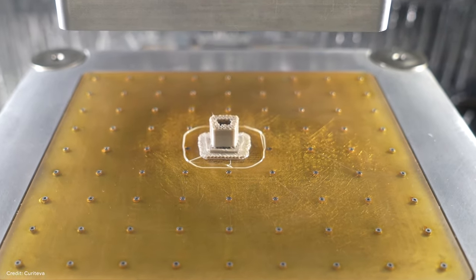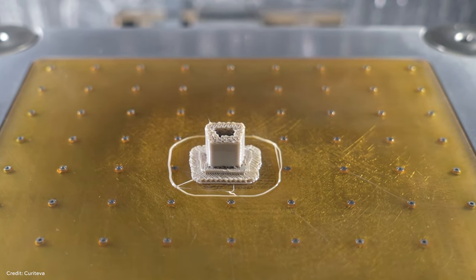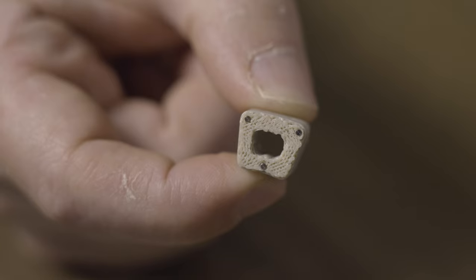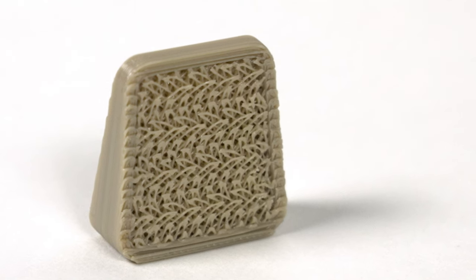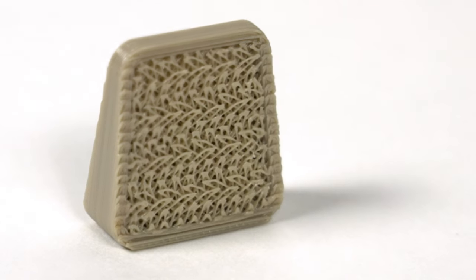The material is not melted all the way. It is in this amorphous crystalline state. And as you look closely at an implant made this way, you can kind of see the taffy strand-like structures, the way that the layers are built out of strands like that. Certainly the way the bone ingrowth geometry, the sort of lattice geometry, is made that way.